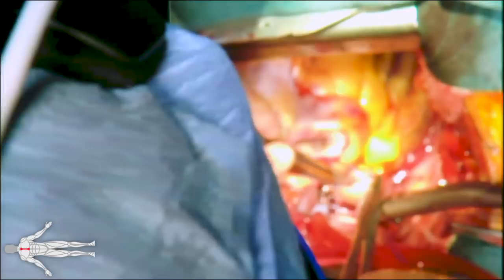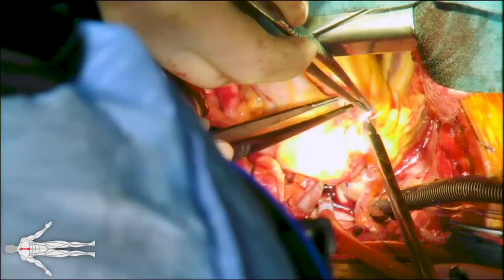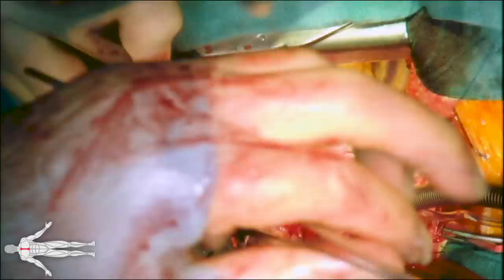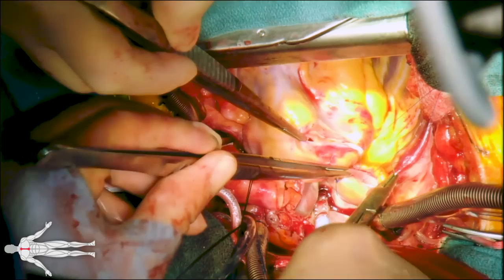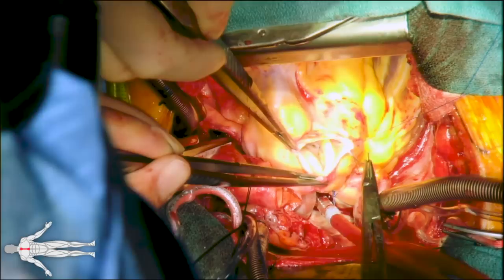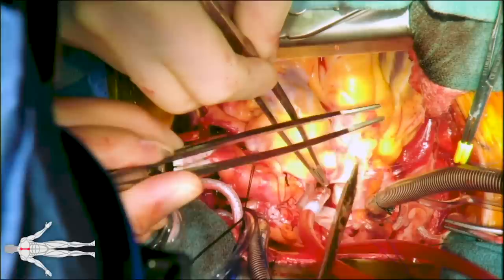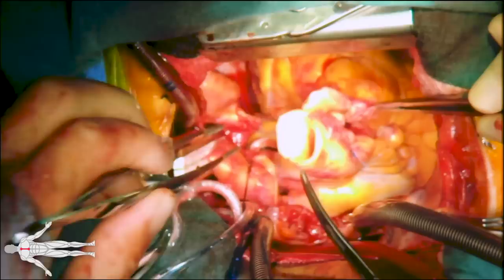We then proceed with constructing an anastomosis between the donor's right atrium and the cuff of right atrium left on the inferior vena cava of the recipient, using a 4-0 Prolene suture in a running fashion. The right atrium to inferior vena cava anastomosis is then completed.